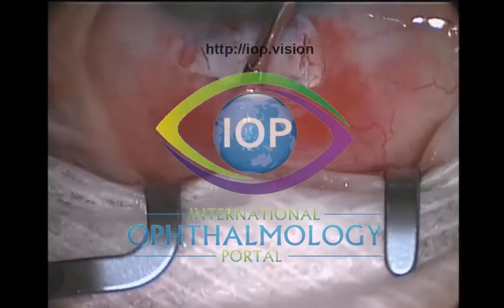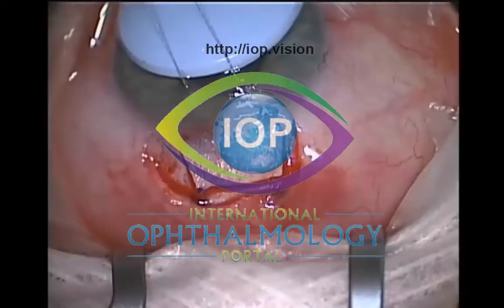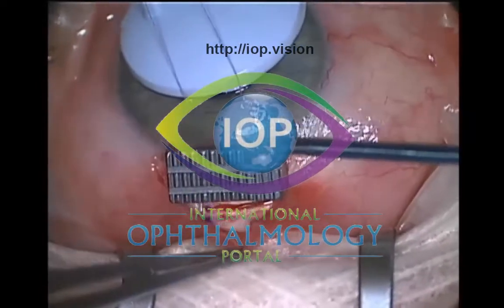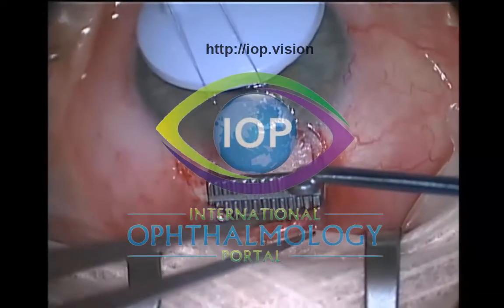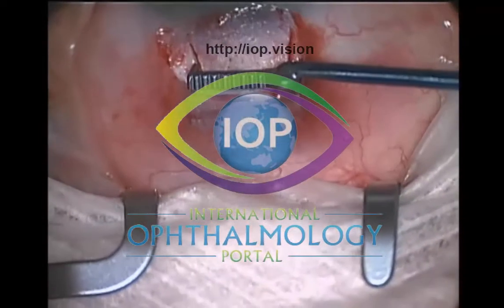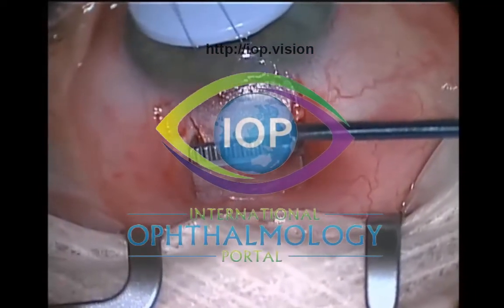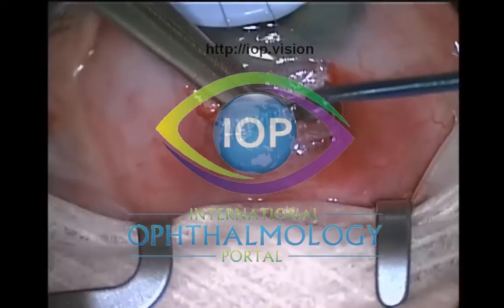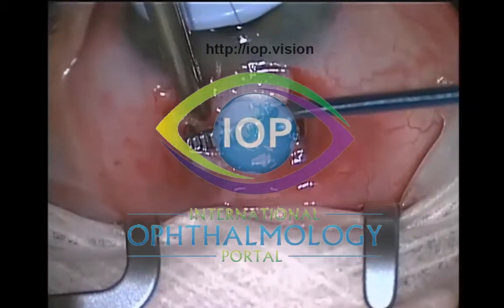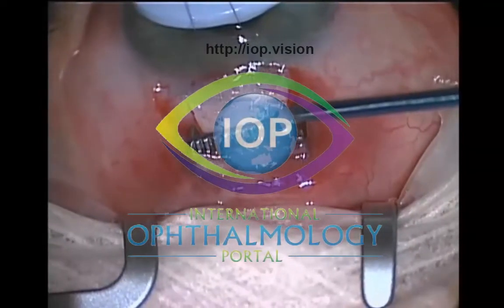The other design feature of this conjunctival retractor is that the retractor itself sits on the sclera whilst you're placing the mitomycin pledgets, and this also helps in terms of you're not holding up a retractor, so it's less fatigue. The other feature of the retractor as well is that it protects that conjunctival edge from exposure to the mitomycin. That's critical because you don't want any mitomycin effect along that conjunctival edge, otherwise post-operatively you're more likely to get conjunctival edge wound leaks.